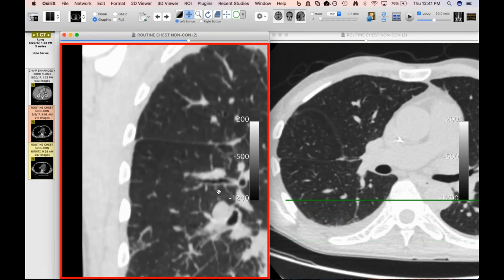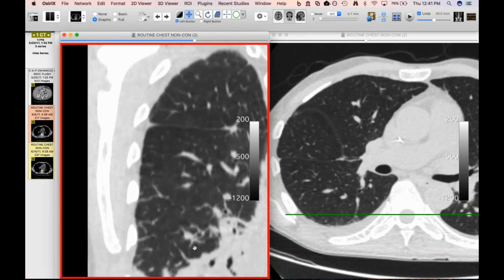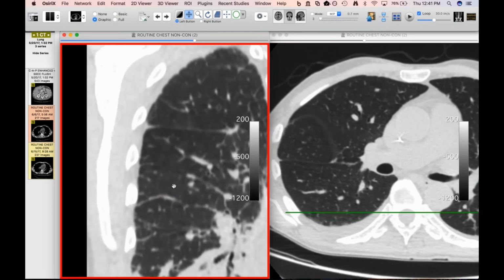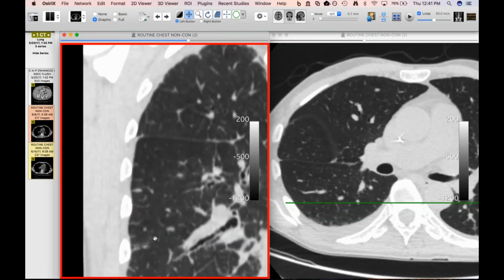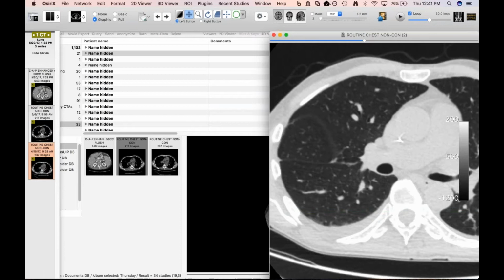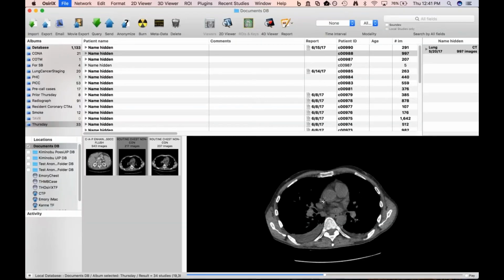I thought this was cute just because we had these three scans over the course of less than a month. And of course, with leukemia or lymphoma or whatever it was, the question was, could any of this have been recurrence or progression of disease? Maybe, but not given the fact that it has gotten better with just diuresis. Yes. All right. Okay. Those are mine for today. All right. Cool.